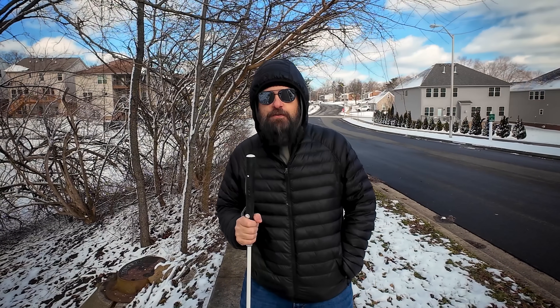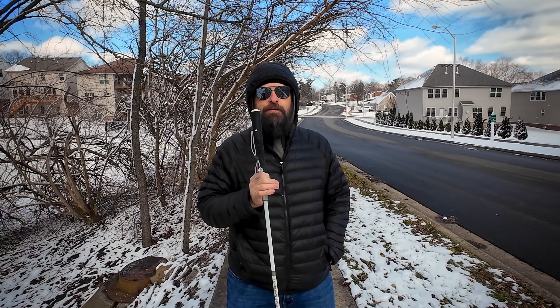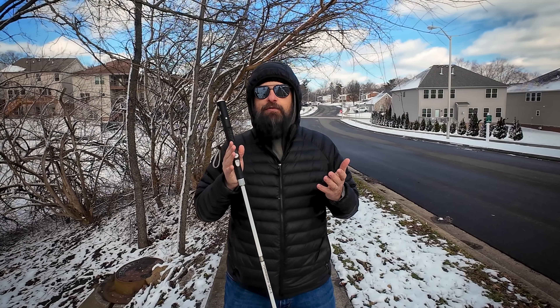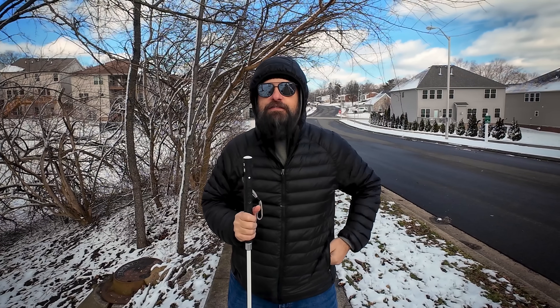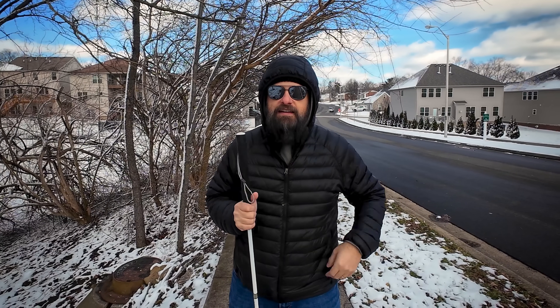That is it for this review of the WeWalk Smart Cane Version 2. Overwhelmingly, I think this is a vast upgrade over the previous version. They've improved everything people had issues with in the first version. The new sensor has a much tighter cone of detection, so it's more accurate to things right in front of you and won't pick up stuff on the side that doesn't matter. It's also much better for detecting doorways. The flashlight is much brighter, and while there's some glare at night, it's fantastic for making you visible to the outside world.